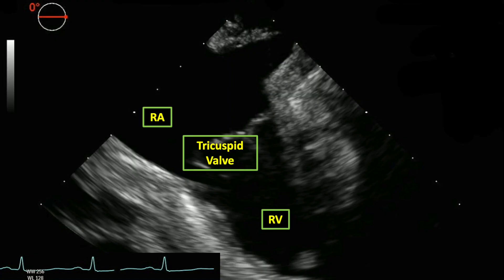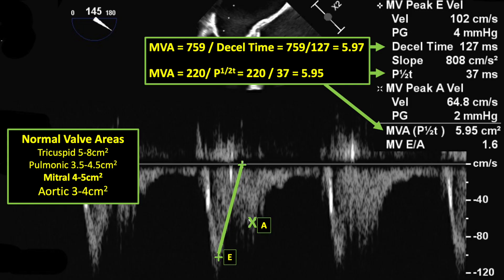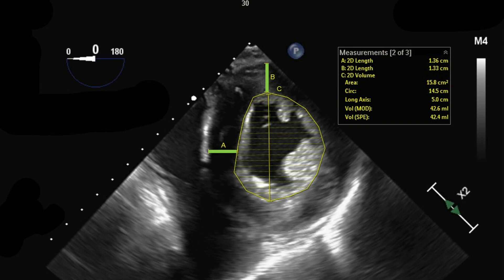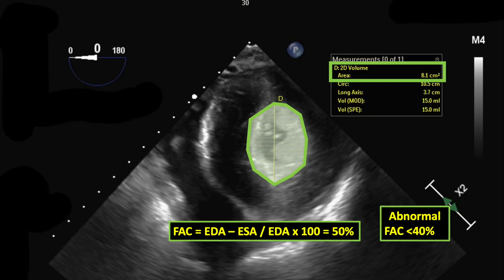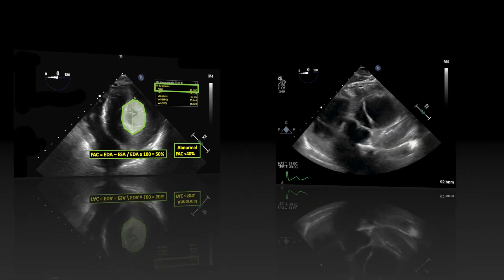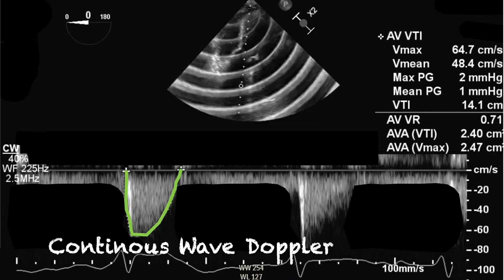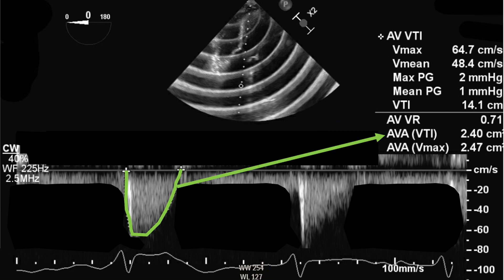En route to the transgastric views, I measure the coronary sinus and capture the mitral valve in cross section to measure its area by planimetry, comparing it to the ones generated by pressure halftime and deceleration time. Advancing further, I measure the left ventricle's wall thickness at end diastole and calculate the fractional area change. In the deep transgastric views, I obtain the left ventricle stroke volume and transaortic valvular gradient, which generate the aortic valve area by the continuity equation.